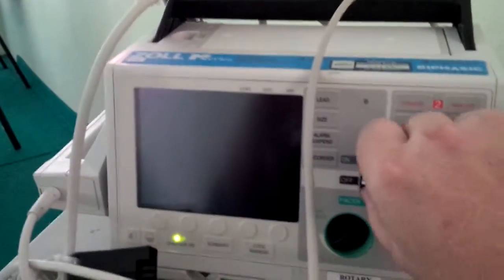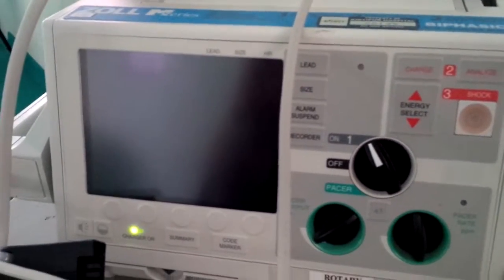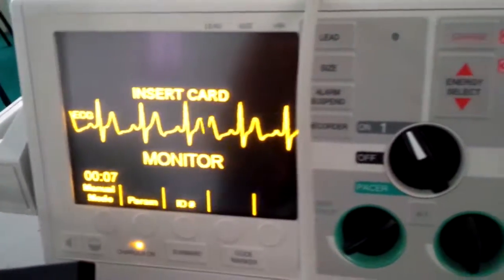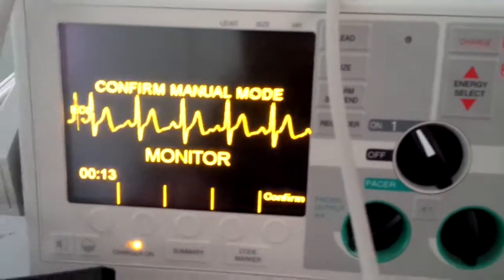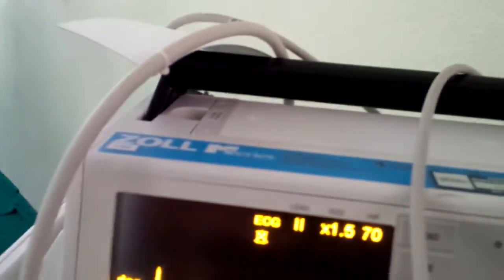We get the monitor and turn it on. The default setting is to use the pads, and it says insert card and monitor — pad setting. But if we want to go to manual mode, which is what I recommend, we hit manual, then we have to hit confirm. Then we go up here and find lead, and get it off paddles onto something else.